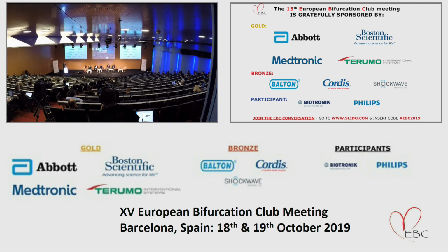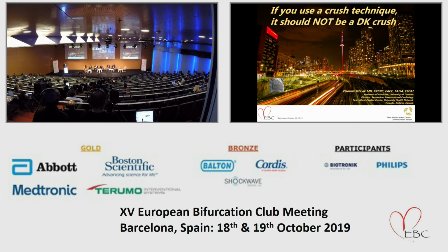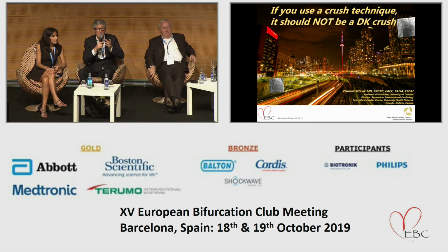The purpose was to improve the rate of final kissing balloon inflation, because with classical crush it was very low, and then it impacted the outcome of the patient. So that's why we decided to have this discussion today, because we have seen crush techniques everywhere in the world. Should we continue to use crush? Because we have better than crush. We have DK crush, or maybe your technique, but it's not compared to other techniques.